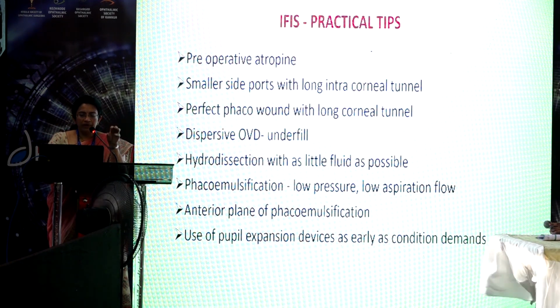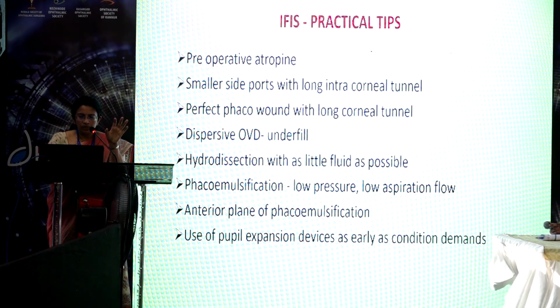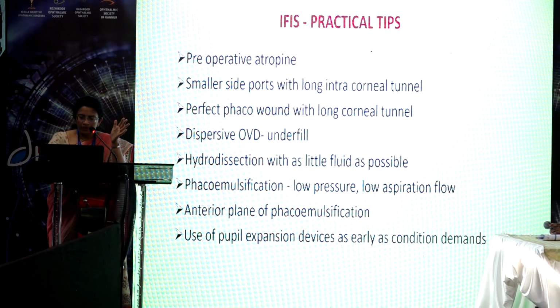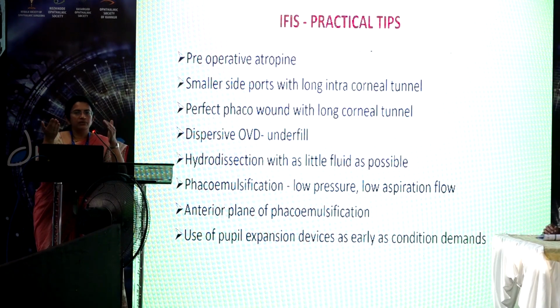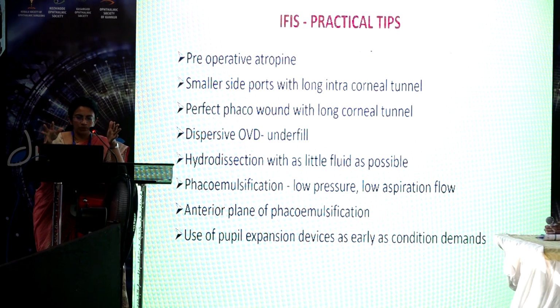And never overinflate the chamber because it is at that time the iris starts coming out. And hydrodissection should be gentle with as little fluid as possible. And phaco should be done with low pressure, low aspiration flow parameters. And you can have a slightly anterior plane emulsification so that the fluid current doesn't go under the iris and lift it up and cause prolapse.